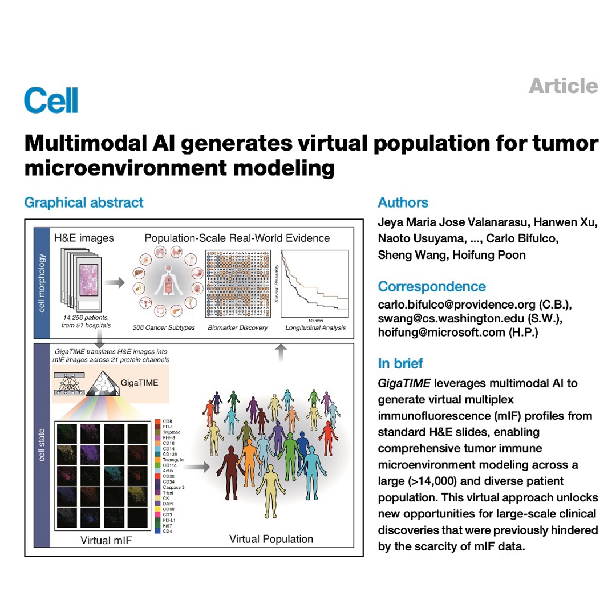Did you really need all 21 proteins? Absolutely. This was one of the most important takeaways. While individual proteins could predict outcomes to some degree, a GigaTIME signature that integrated all 21 channels was demonstrably superior for predicting patient survival. So it confirms the need to move beyond single marker thinking. It proves it. The whole is truly greater than the sum of its parts here.